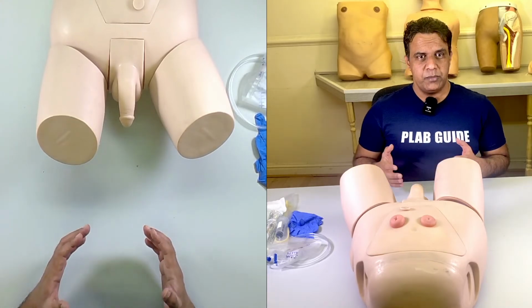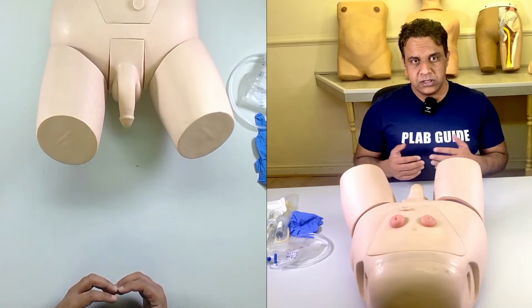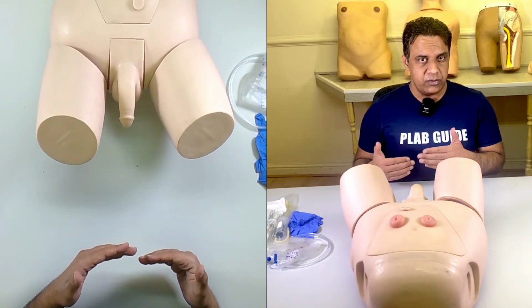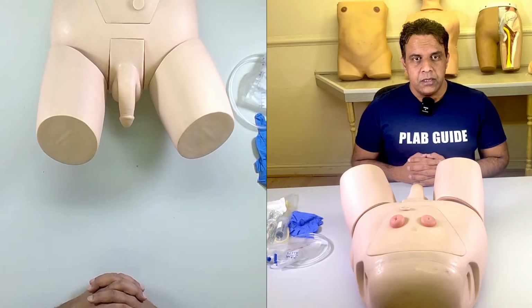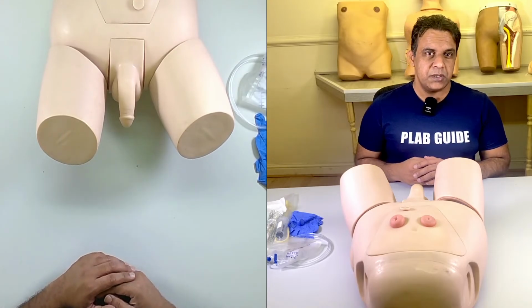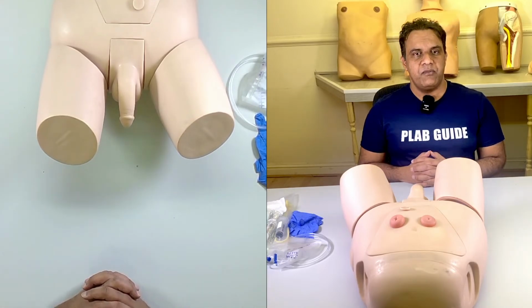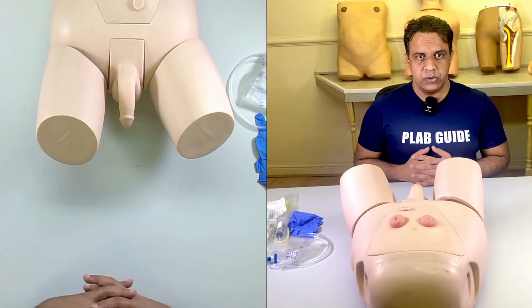Then also make sure that you explain the procedure to the patient. Say for example, if the patient comes with urinary obstruction, make sure that you explain why you need it and what's the benefit of having the catheter. And before you perform the catheterization, it is important that you know the residual volume of the urine by performing a bladder scan.